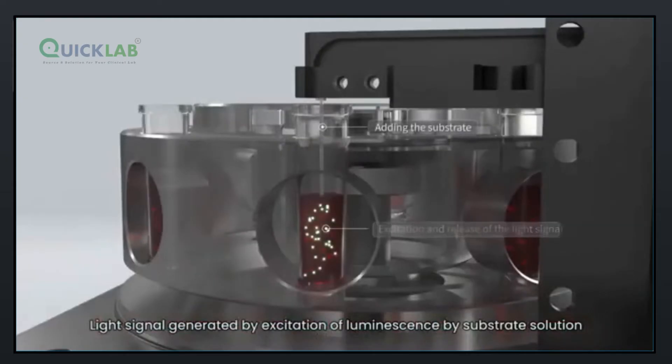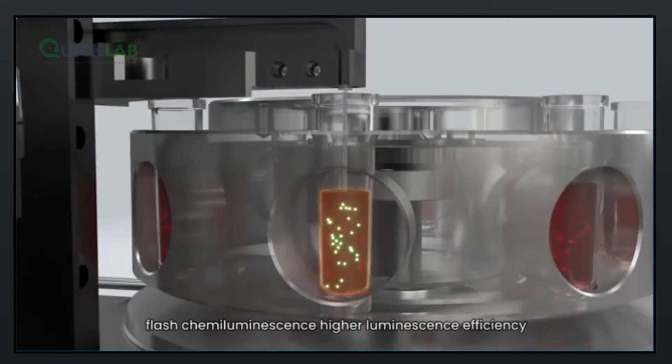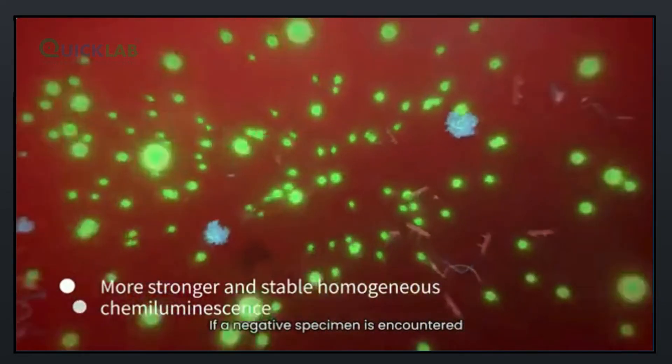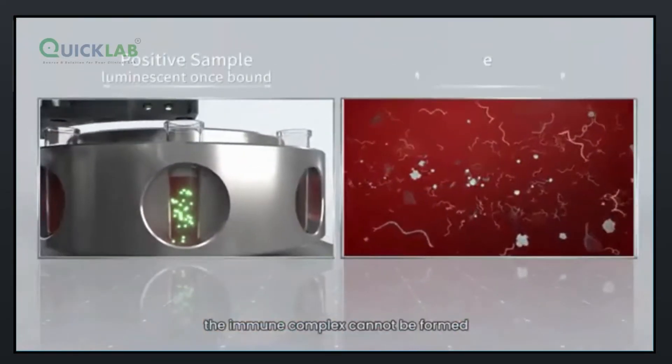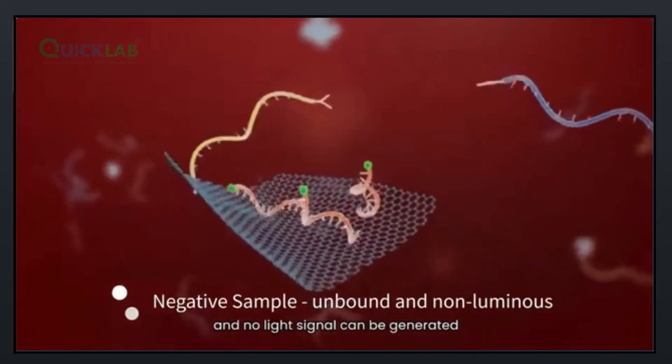Light signal is generated by excitation of luminescence by substrate solution. Flash chemiluminescence provides higher luminescence efficiency and more sensitive detection. If a negative specimen is encountered, the immune complex cannot be formed, and no light signal can be generated.